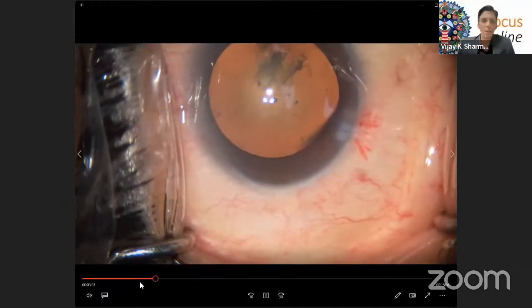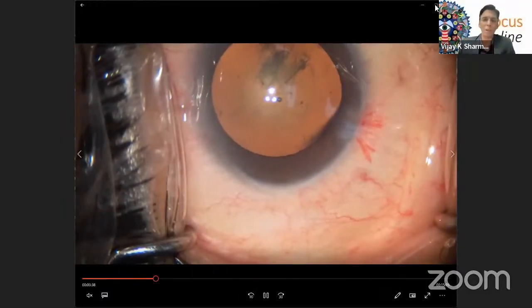It will be good. Yeah, I'll just add one thing. Once the question of scissor has come up, I think I missed out one slide, and that is a situation when we have a calcified anterior capsule. Yes. Those conditions, again, we need to cut it with the scissors and complete the rexis. There's no other way out, basically. Right, sir. So in that case, bimanually, with one you can hold the rexis margin, and with the other you can use the scissor and cut the margin.